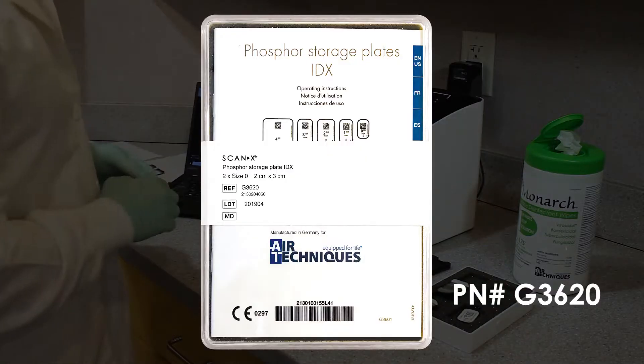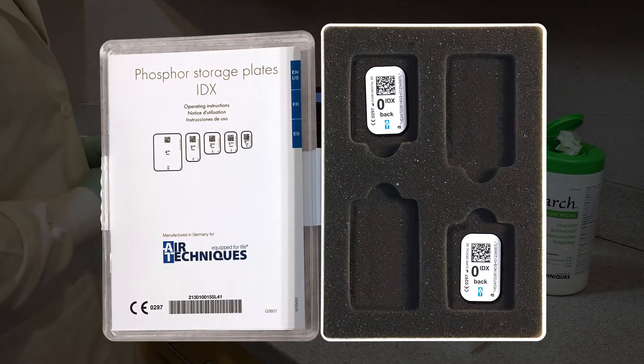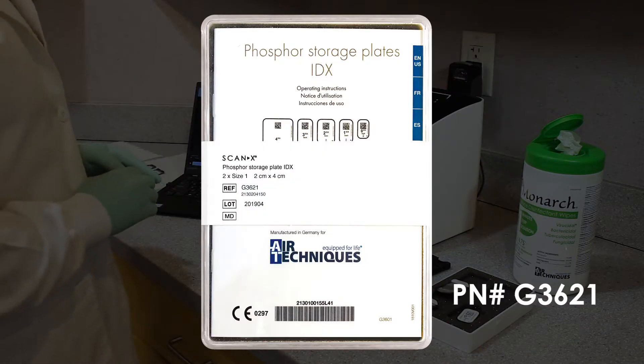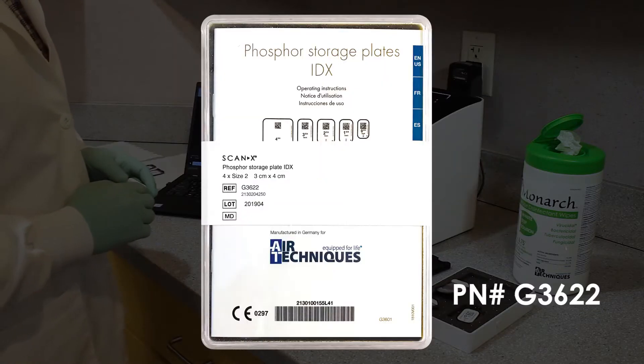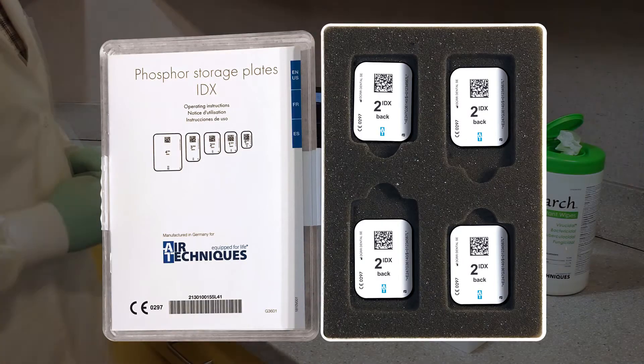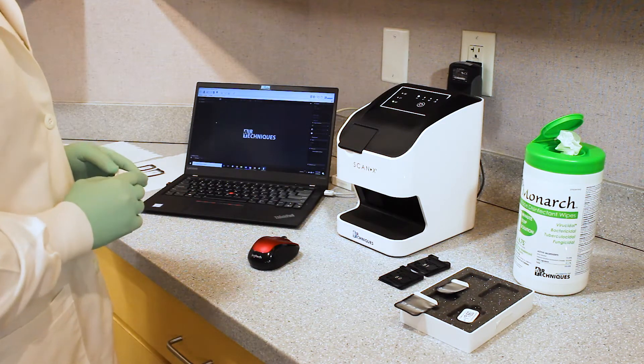You are looking at G3620 for the size 0, package of 2. You are looking at G3621, which is the size number 1, package of 2. And then G3622, which is the size number 2, package of 4, like our other phosphor storage plates.